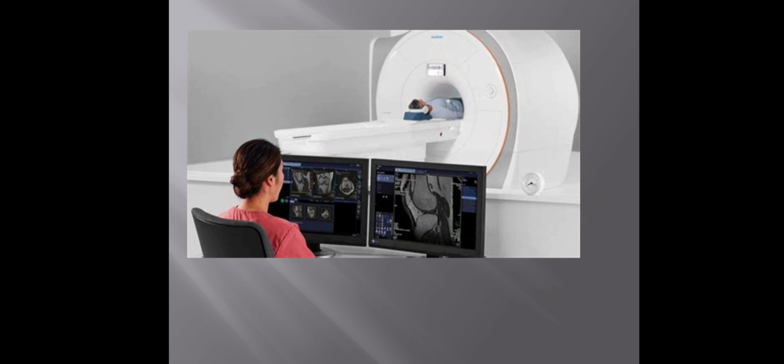Certain atomic nuclei are able to absorb radio frequency energy when placed in an external magnetic field. The resulting evolving spin polarization can induce an RF signal in a radio frequency coil and thereby be detected. In clinical and research MRI, hydrogen atoms are most often used to generate a macroscopic polarization that is detected by antenna close to the subject being examined.